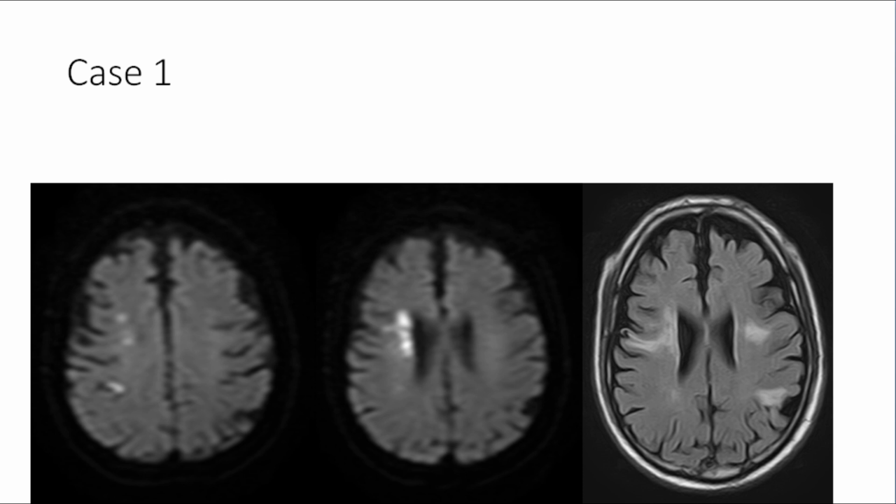What do you think about these two? These were not there before. So these are old strokes. Does this stroke and this stroke match? No. For sake of time, I know it's taking long. So these two strokes don't match, because these two are embolic.